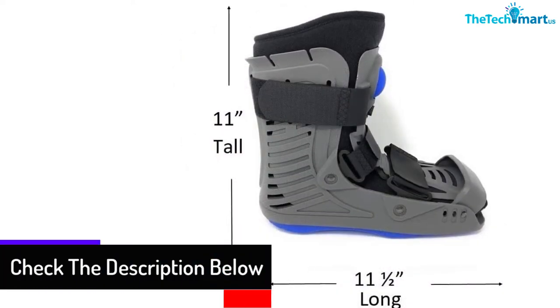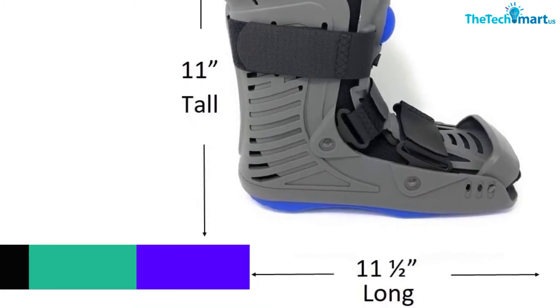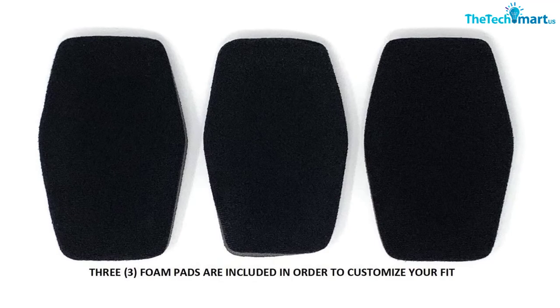Furthermore, the closed-toe airliner keeps your foot and ankle comfortable in any condition. The adjustable toe guard offers additional protection to your leg. With the help of an inflatable bladder, the boot immobilizes your ankle, foot, and lower leg.